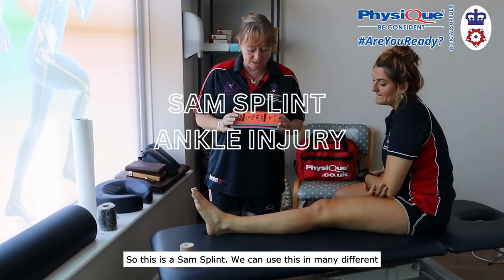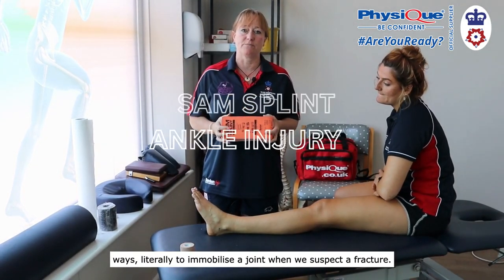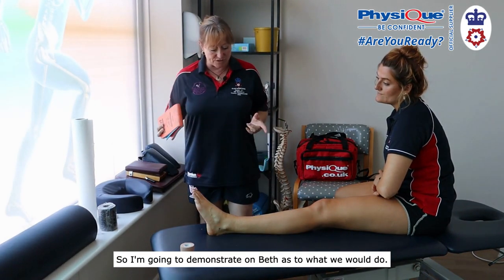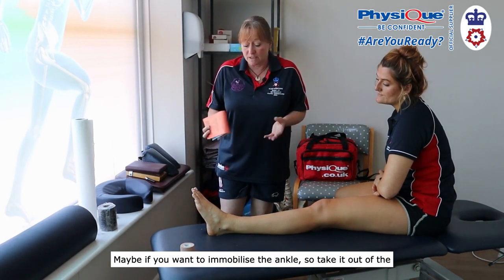So this is a SAM splint. We can use this in many different ways — literally to immobilize a joint when we suspect a fracture. I'm going to demonstrate on Beth as to what we would do if you want to immobilize the ankle.